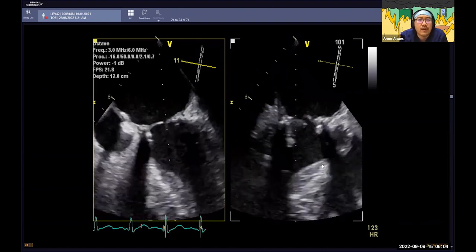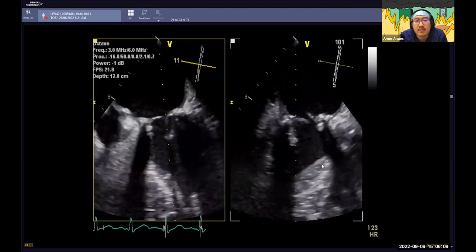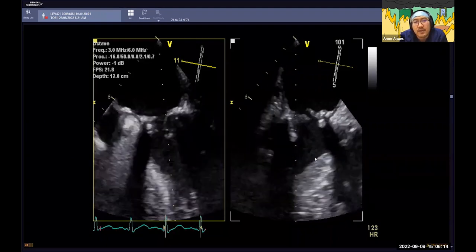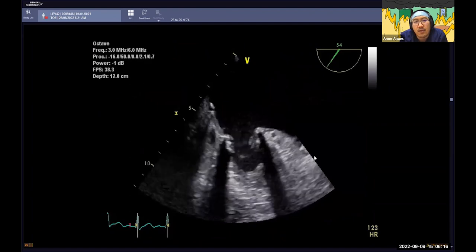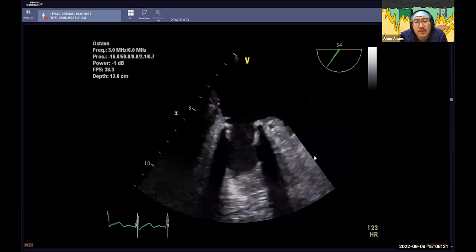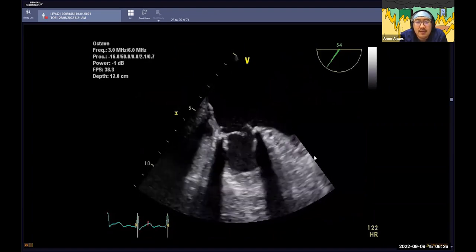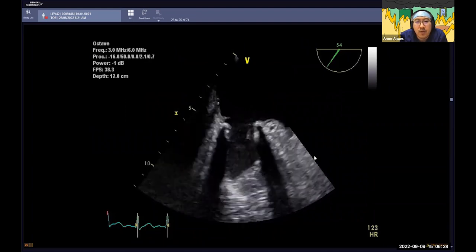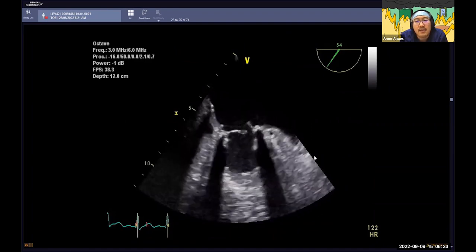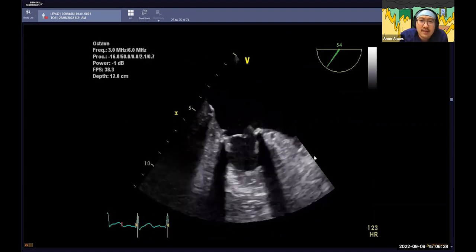And so in terms of workflow, we drop the probe and my first images would be half a dozen 3D images of this mitral valve. There'd be no 4 chambers, there'd be no deep transgastrics. The first image would be a live 3D volume of the mitral valve, which would show you what you're seeing in X-plane there. We saw some of the aortic valve 3Ds previously. They still remain quite underwhelming in my experience. But this is okay. We see a lot of stuff like this at 50 omniplane with the appendage in. The patient seems to still possess the appendage.